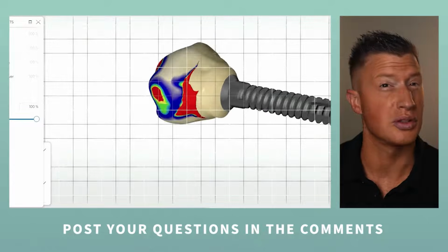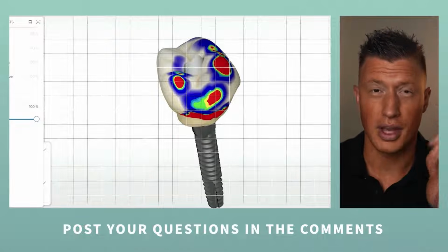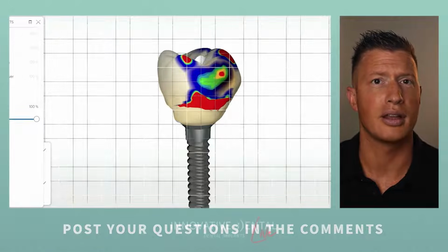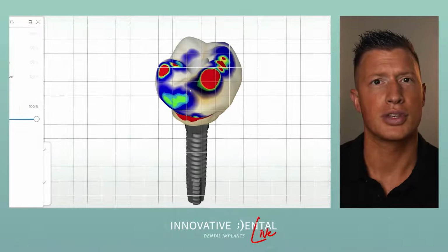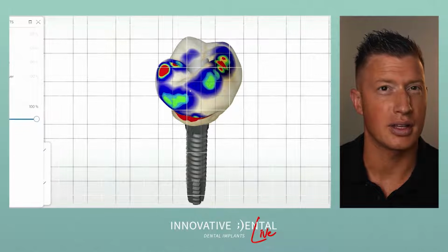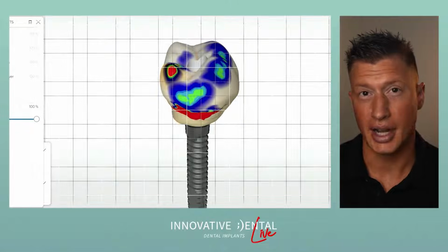This is a really important tooth for her because as she's chewing, she's going to be chewing on the other side and wearing down other teeth. This one's really helpful for that. So what I'm doing right now is I'm adjusting the shape, smoothing it out, addressing contacts because I want to make sure that when she flosses, it snaps correctly. You'll notice that I'm going around and making sure that she's not biting too hard. And so that red is basically spots where the bite is going to be a little heavy. I'm getting that down to green because I know in the software when we have right around green, that's going to be a good bite.